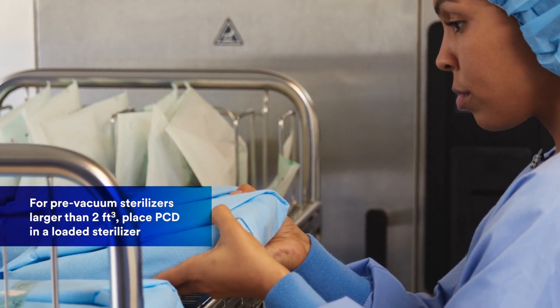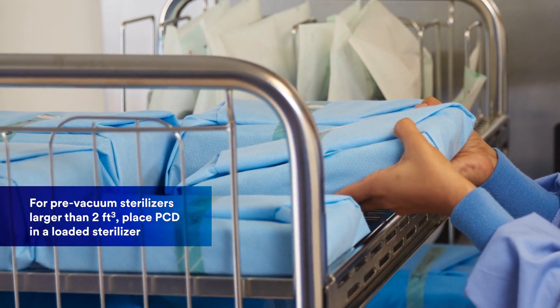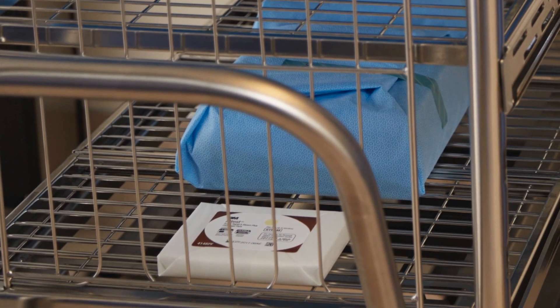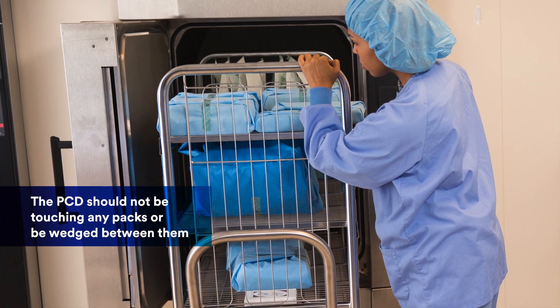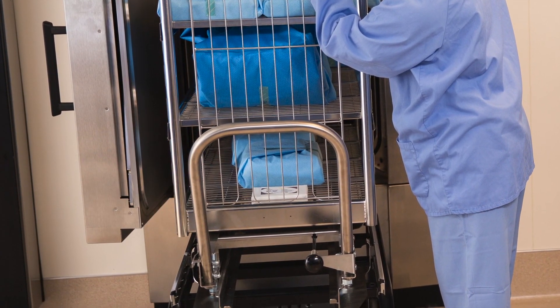For pre-vacuum sterilizers larger than two cubic feet, place the PCD in a loaded sterilizer, typically on the bottom shelf over the drain. The PCD should not be touching any packs or be wedged between them. It should stand alone and leave the label face up.